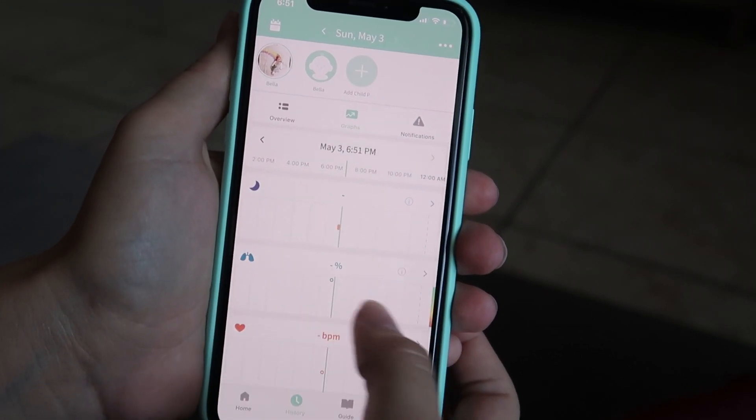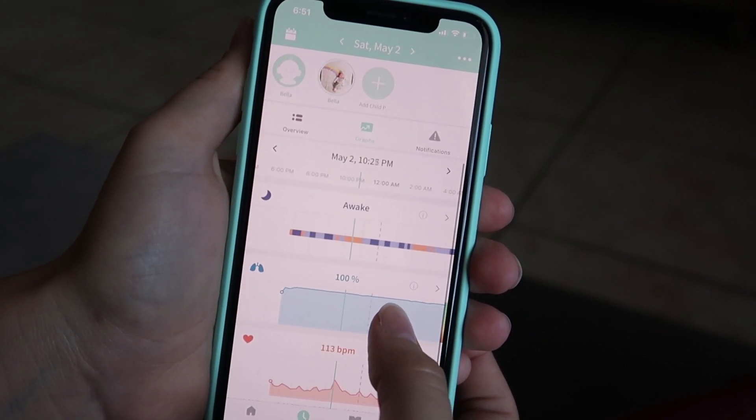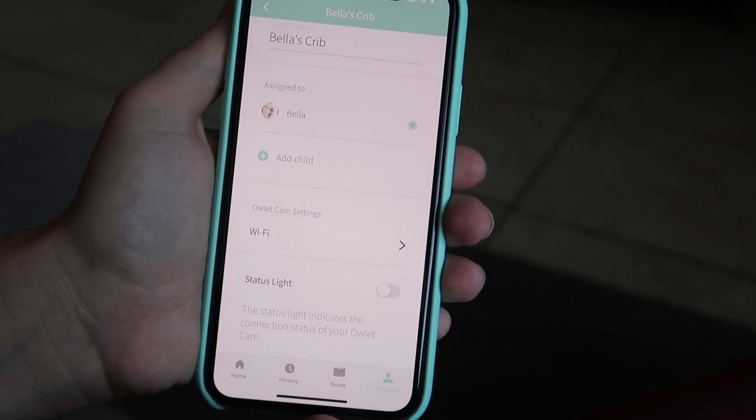The smart sock tracks sleep and you can go in the app and review sleep history — seeing all the times they woke up, when they were in a light sleep or a deep sleep. We really like this feature because she typically wakes up a good hour before she even starts to fuss in the mornings. We can check the history to see when she actually woke up so we know when her next nap is supposed to be.